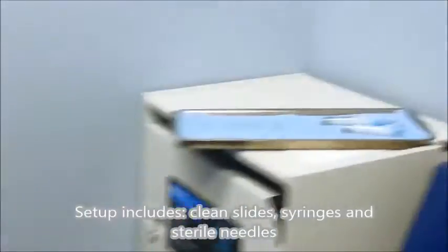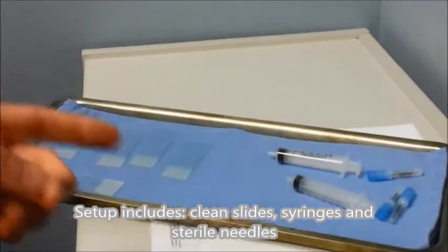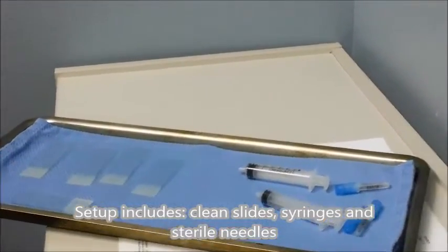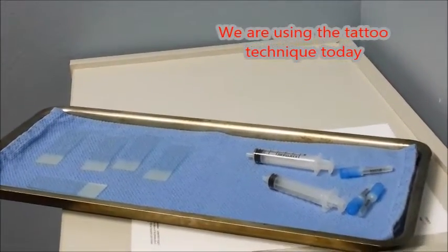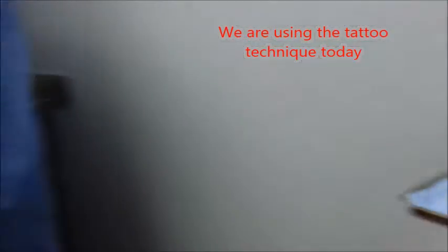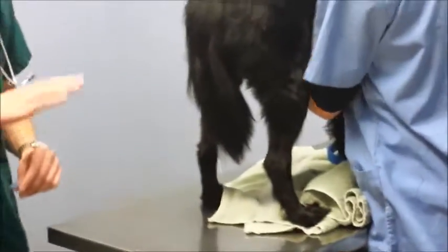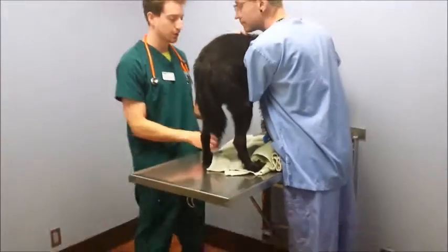Let's move over to the setup real quick. I've got several slides laid out, some sterile needles, and some syringes. What I'm going to use is something called the tattoo technique. I'll take one of these new sterile needles, and a lot of times I don't do a lot of prep on the skin because I want to see what kind of cells are there under a microscope.